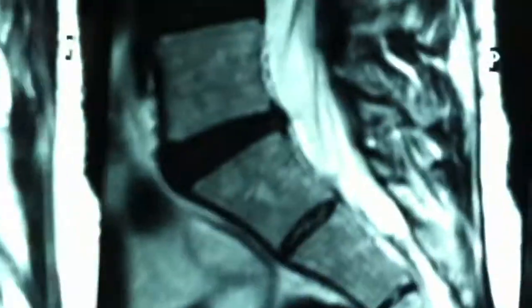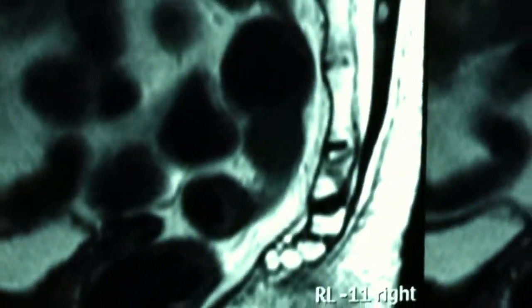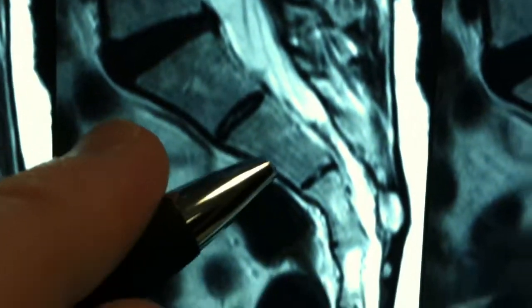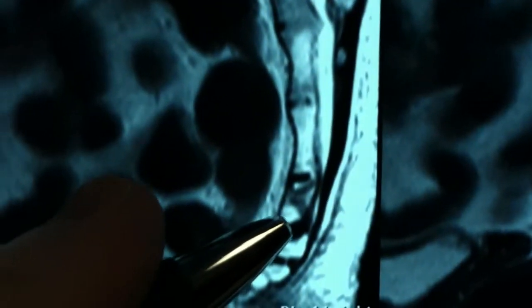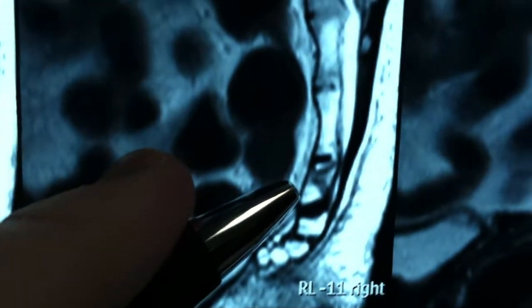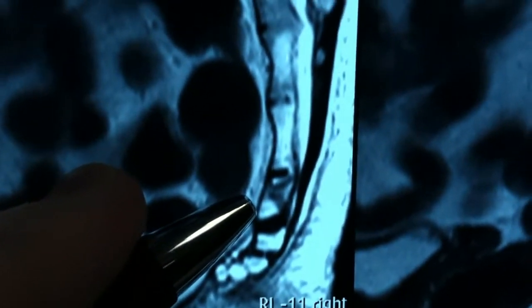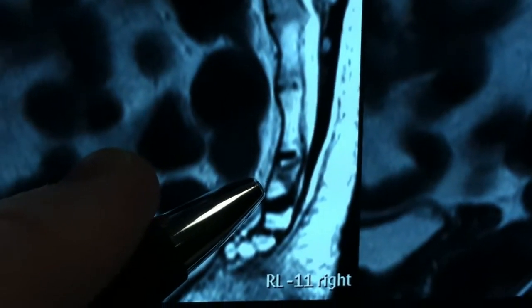I'm going to come down to another image here. Again, looking at the sacrum and coming down the sacrum, and then that bony segment right there where you can see the fracture is present.